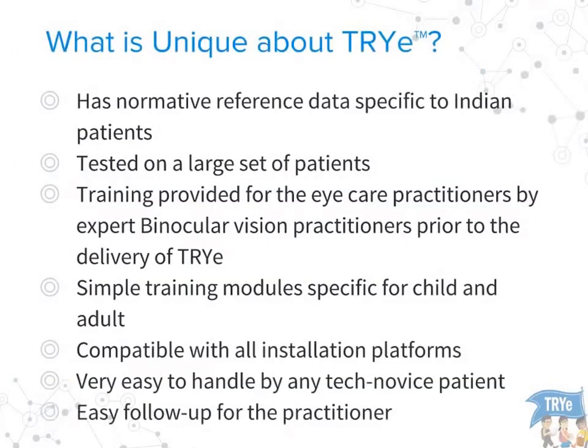Some of you might already be using an imported vision therapy software or must have at least heard about it. But what does TRYe have to offer? TRYe has normative reference data specific to our Indian patients, and it has already been tested on a large patient database. When we offer you TRYe, we also provide training for the eye care practitioners by our expert BV team prior to the delivery of the software.